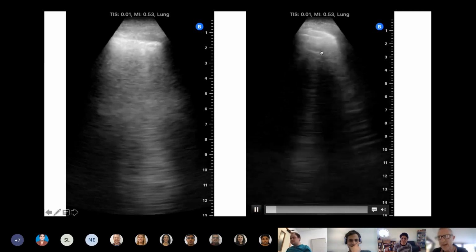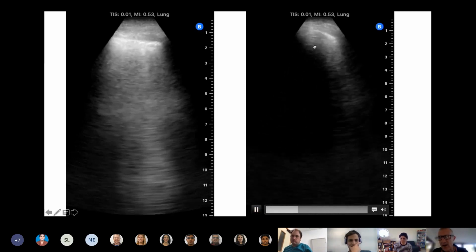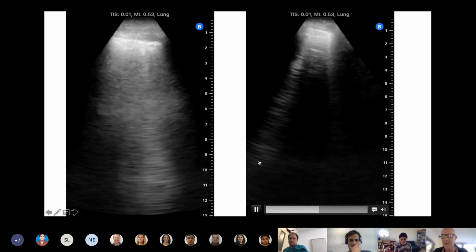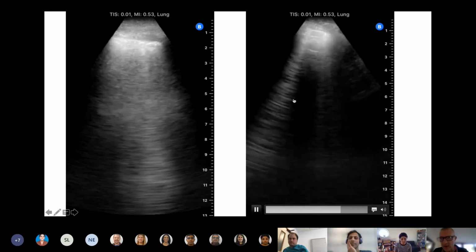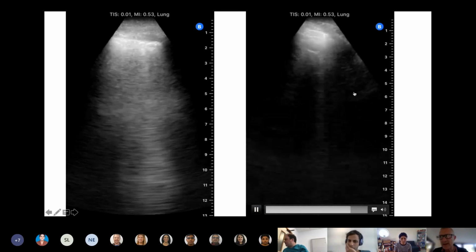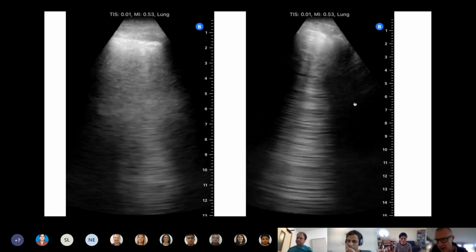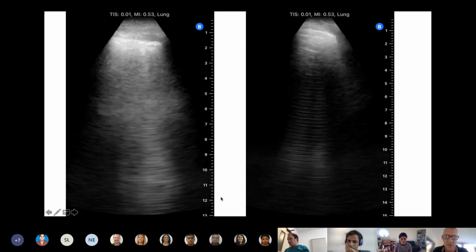And here's another one. Again, we've got some A lines here. These are the sort of harmonics, if you like, that the artifact produced in normal lung, and the B lines cutting across them and obliterating them, and a couple of B lines here coalescing to be quite bright lines down on this side, and sliding too. So already you're getting a sense that you can see COVID change in the lung, and obviously she's PCR positive, but clearly you've got the impact of the virus on the lung. However, you know that her stats are normal.